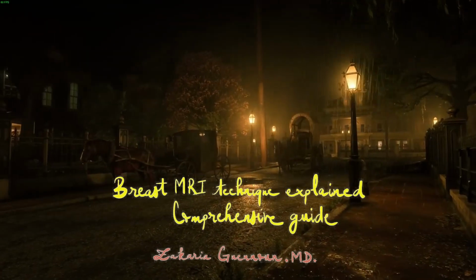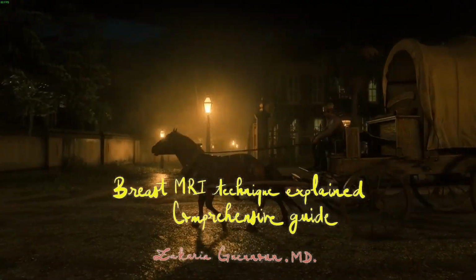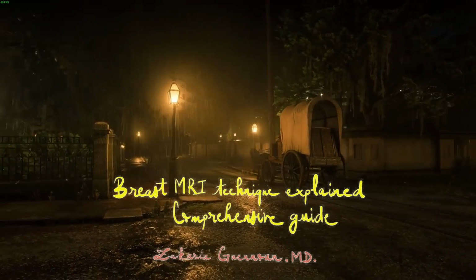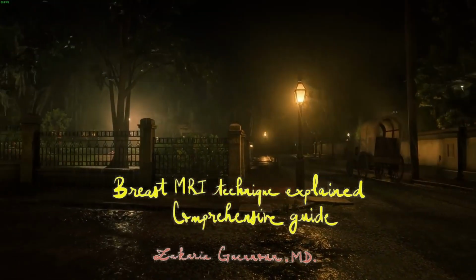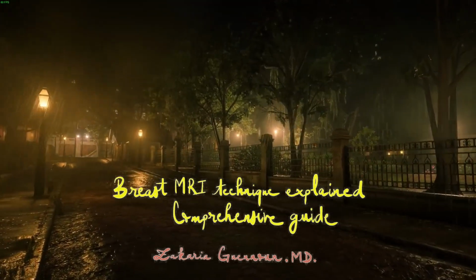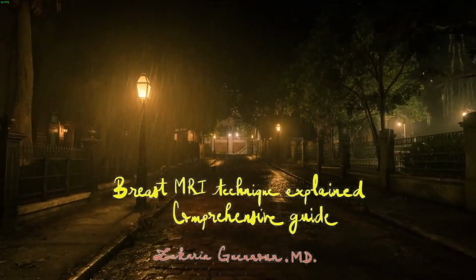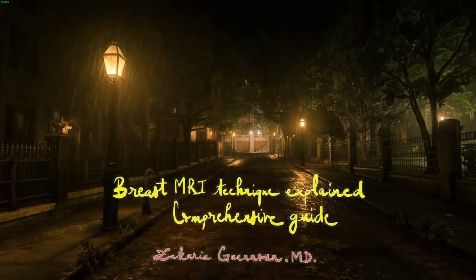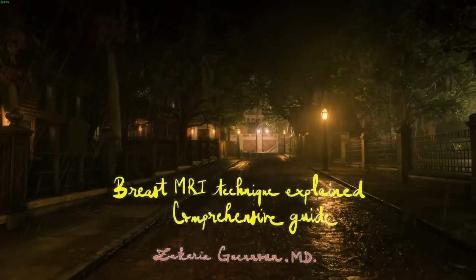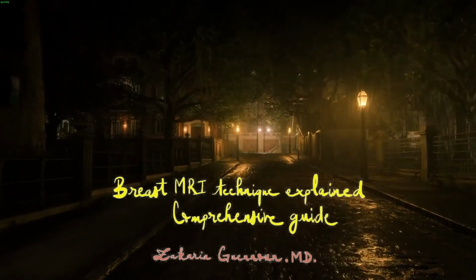As for the dynamic protocol, it consists of 1 pre-contrast scan and 3 to 5 post-contrast scans, each lasting 60 seconds. Each scan is separated by a 10-second delay. And we know for sure that the peak of contrast enhancement for breast cancer will be reached at 90 seconds after contrast injection, in such a way that it will be seen in the second post-contrast scan phase. But either way, you'll have to also compare the first post-contrast phase to the last post-contrast phase to evaluate the behavior of contrast enhancement of a lesion.